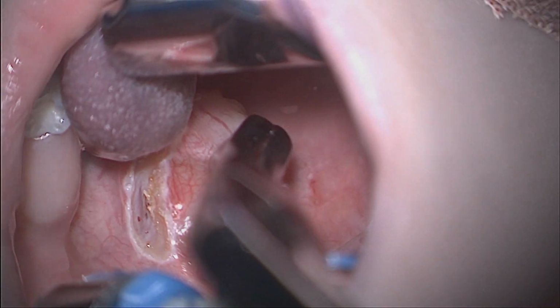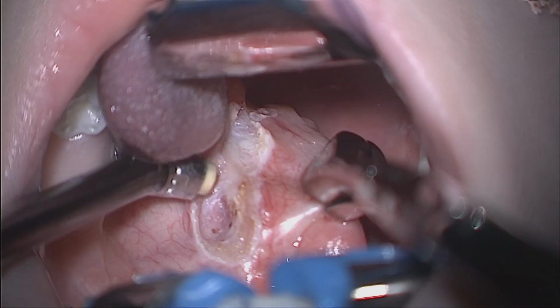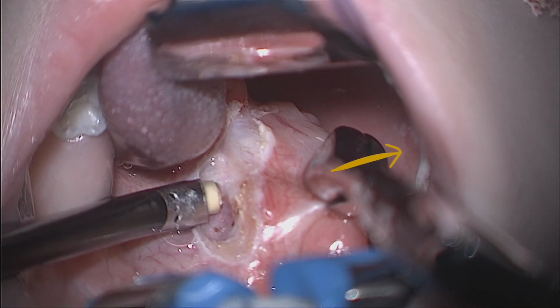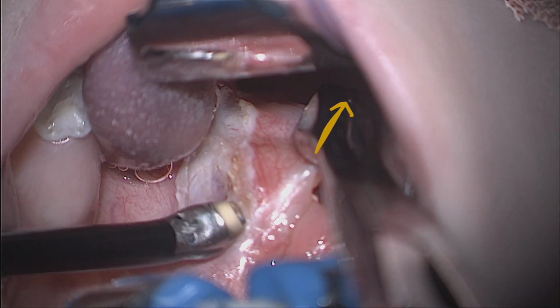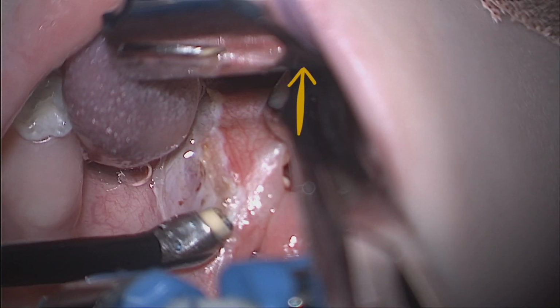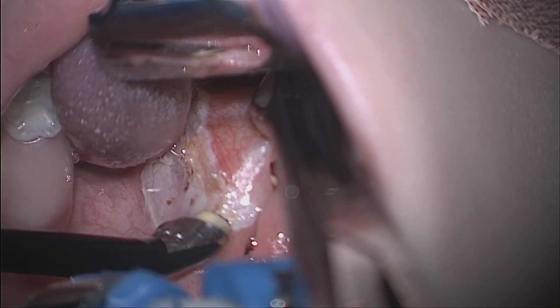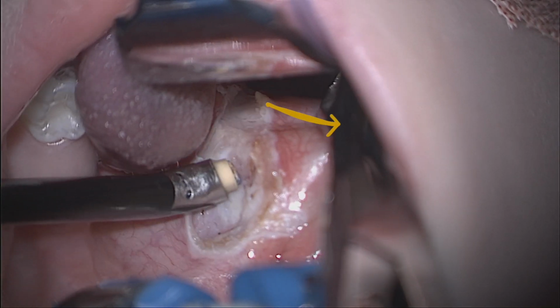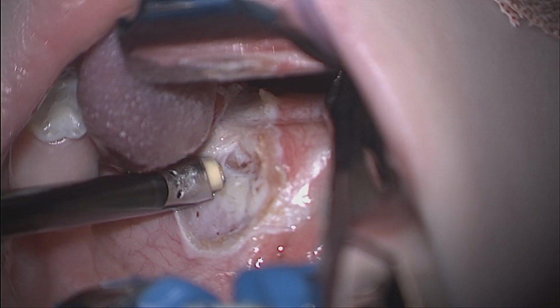As before, the hand which is grasping the tonsil often plays as much of an active role in dissection as the hand using the coblator. This hand should consistently apply traction in a vector that opens up the plane, facilitating dissection by the coblator. Often the optimal vector will require the tonsil to be re-grasped in a different position, and so the surgeon should develop an understanding of how to use the non-coblating hand effectively.